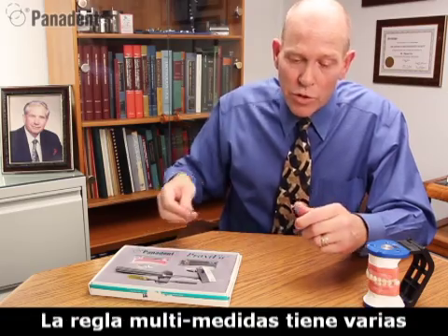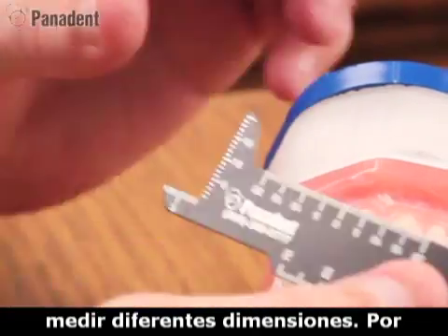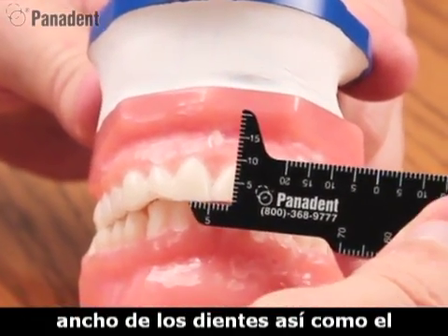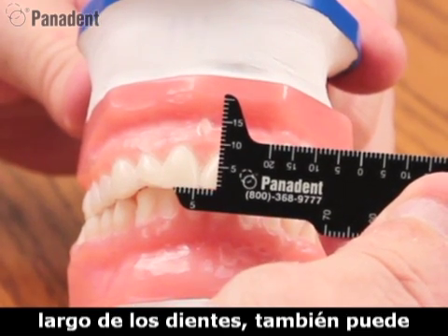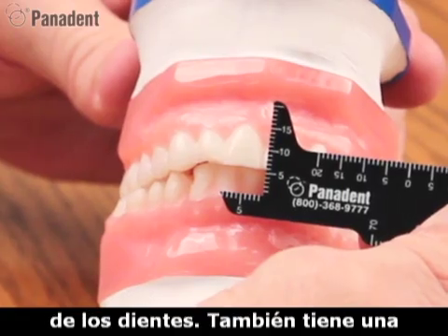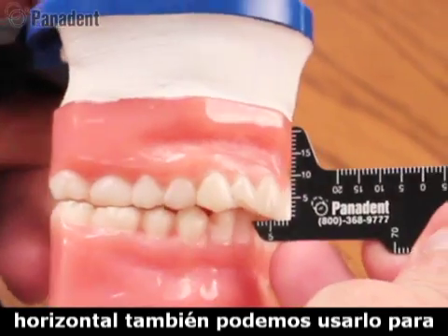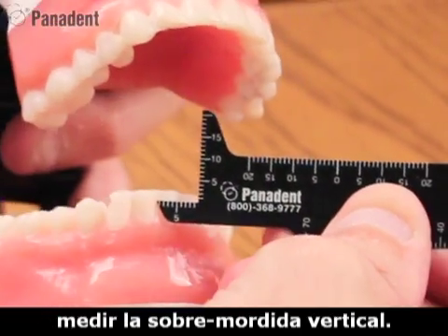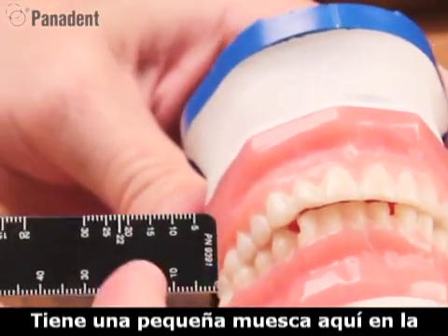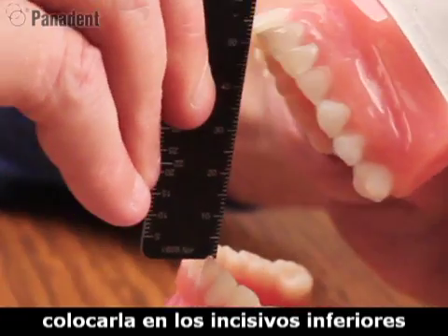The multi-measuring ruler has many scales on it to help us measure different dimensions. We can use it to help measure tooth widths as well as tooth lengths. You can also measure CEJ to CEJ. It has a horizontal overbite scale, and then we can index that to measure vertical overbite. It also has a little notch at the bottom that we can use to notch onto the lower incisor for opening range of motion.